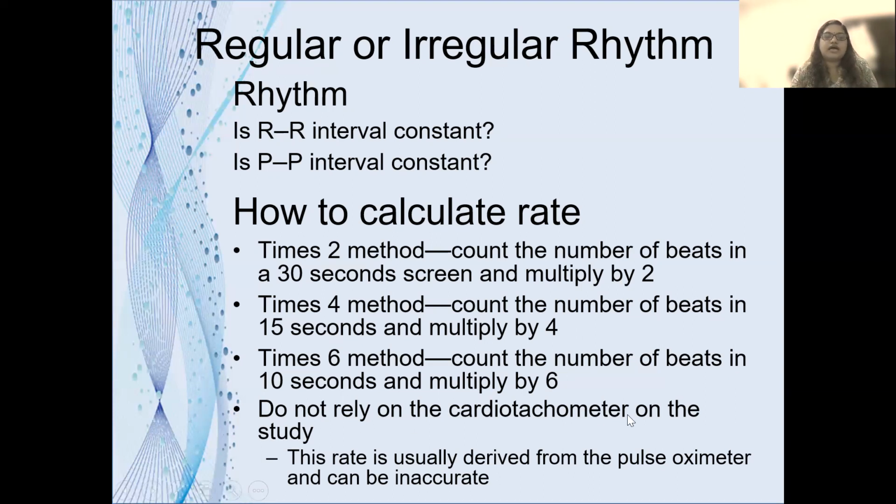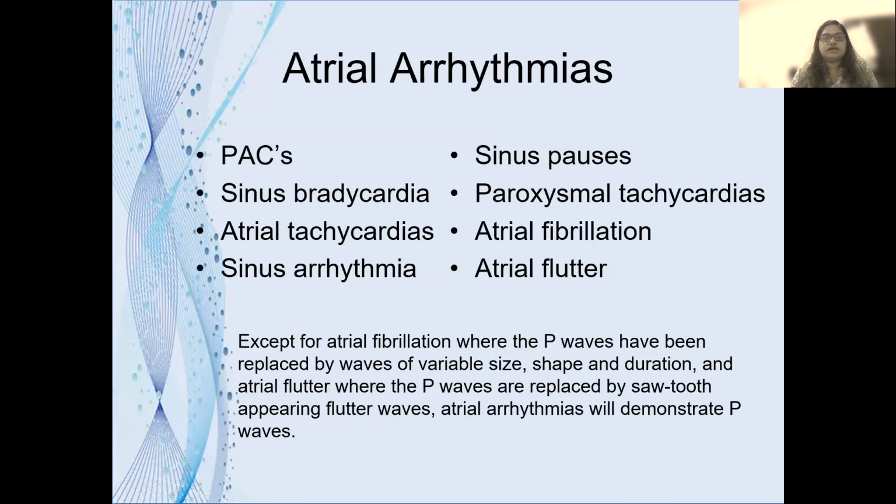Do not rely on the cardiotachometer on the study. You have to see the actual rate. This rate is usually derived from the pulse oximeter and can be inaccurate. So you have to actually see the ECG rate.